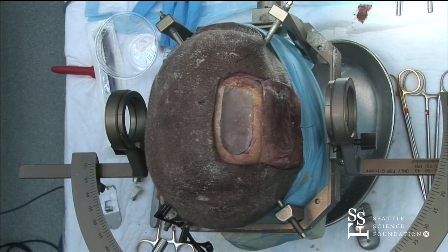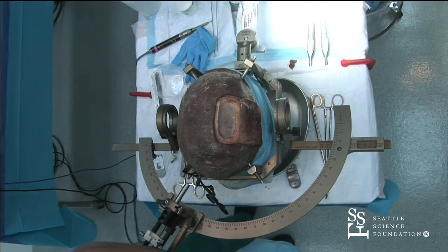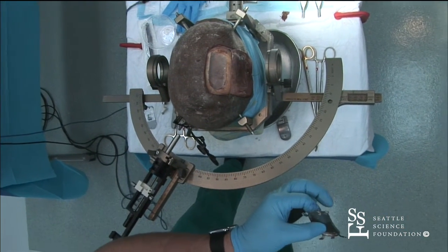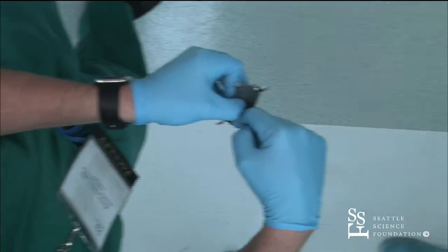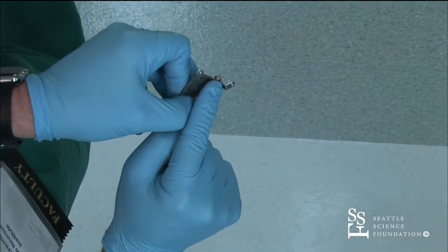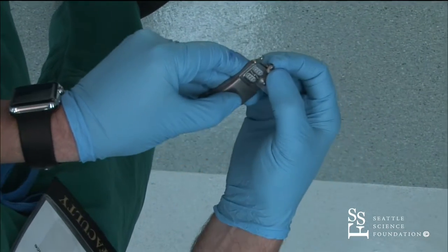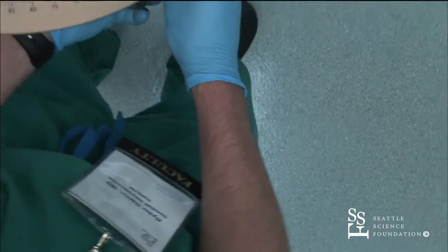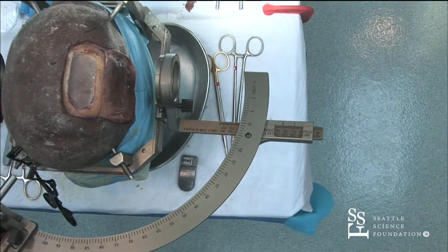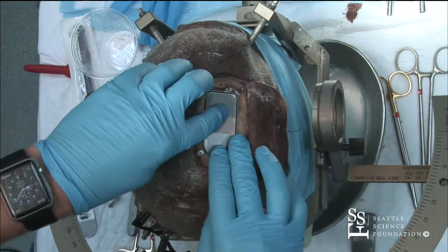This is called the ferule. And you can see the ferule has 4 pieces that will attach to the skull. There's also a little hook here that holds the battery in on this end. And then there's a locking screw right here, which will go over the battery when you lock it down, and that's what holds in the IPG. So you have to make sure that they're all available and not being blocked by bone.